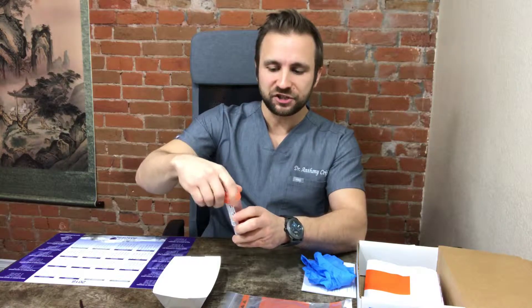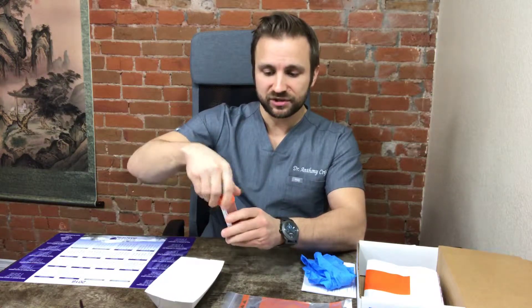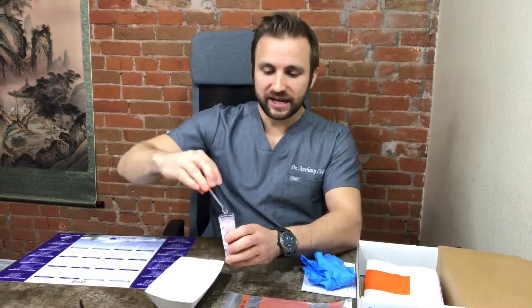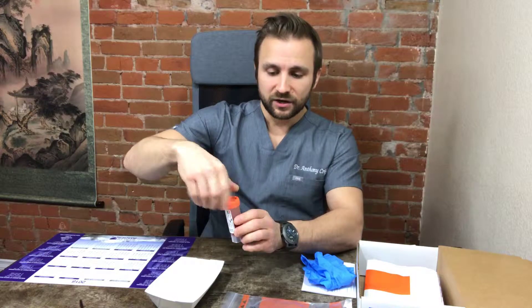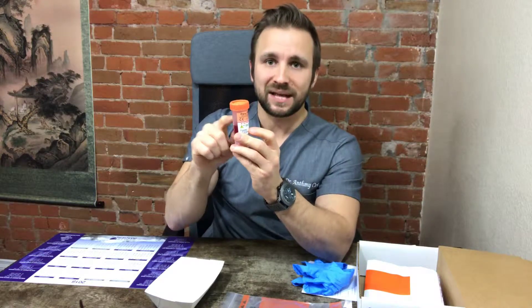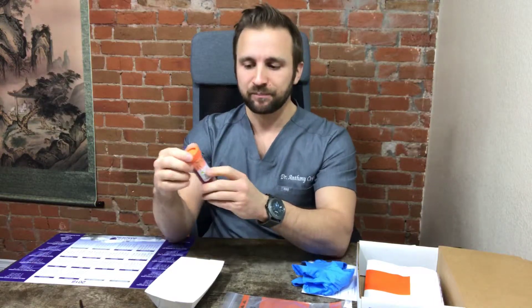Stir the sample and then shake it for 30 seconds. There is a red line on the front of the vial that says 'add specimen to this line.' You don't want to fill it past that line — just add a little bit of stool until you reach it. We want to make sure we follow all these directions precisely so you don't have to redo the sample.